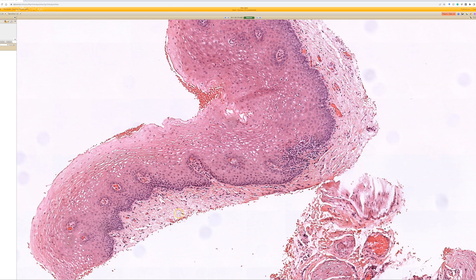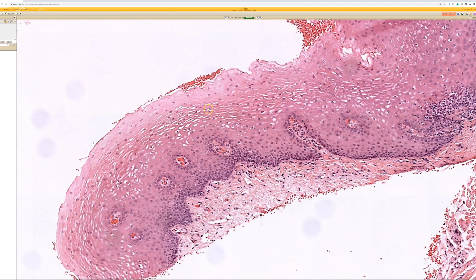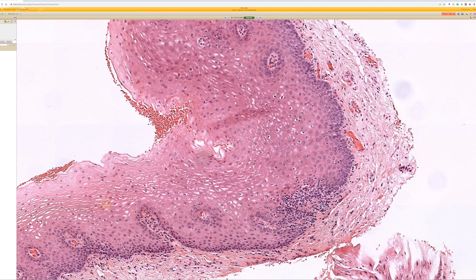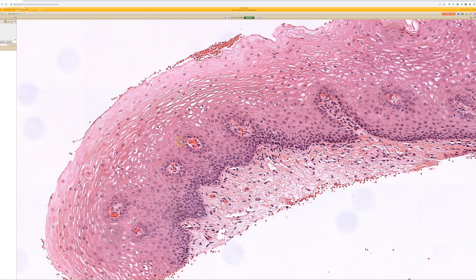Also, to tell us it's mucosa, you don't see adnexal structures like hair follicles. And the third thing that helps us is squamous mucosa usually has increased glycogen content, so it gives this pale, washed-out appearance to the keratinocytes. They look very pale and different, whereas in skin the keratinocytes are much more dense pink cytoplasm and not so pale.